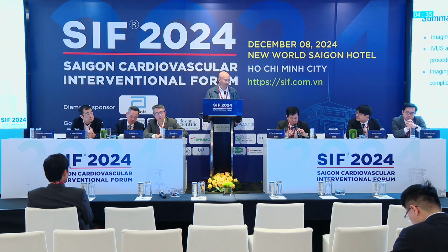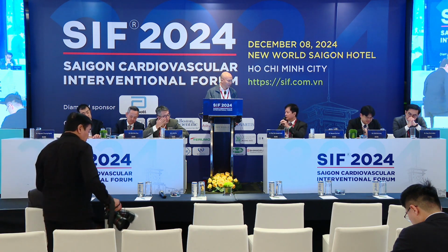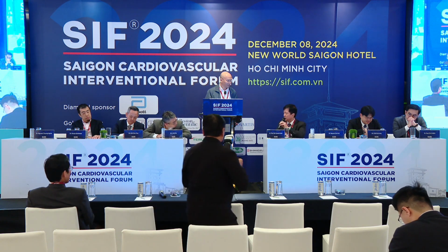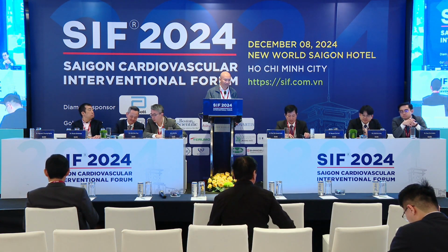I have one question for Dr. Van and Dr. Huy. In all the patients you do left main PCI, do you use IVUS or OCT, or in some patients do you use only the angiogram? In my center, we have IVUS available, so when we do left main PCI, we always check by IVUS before and after.